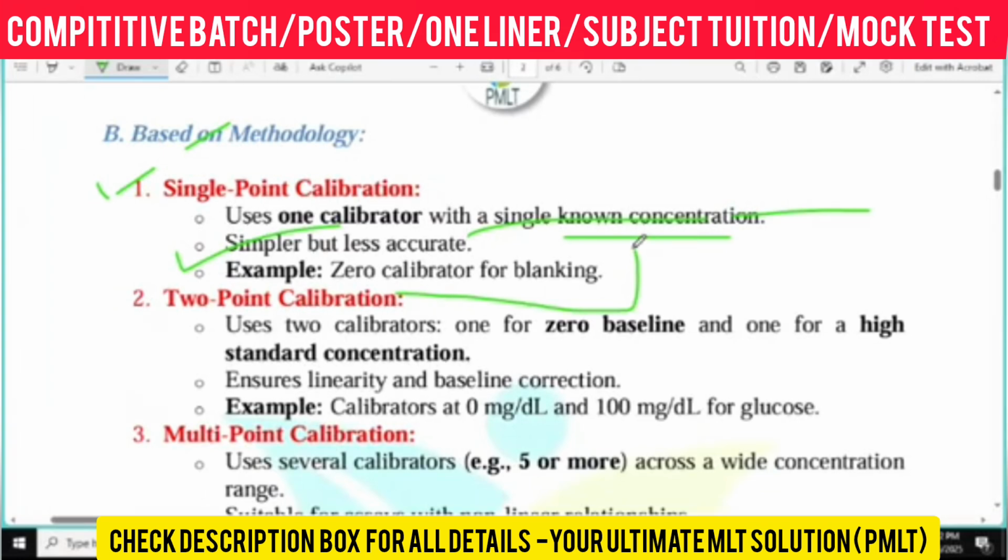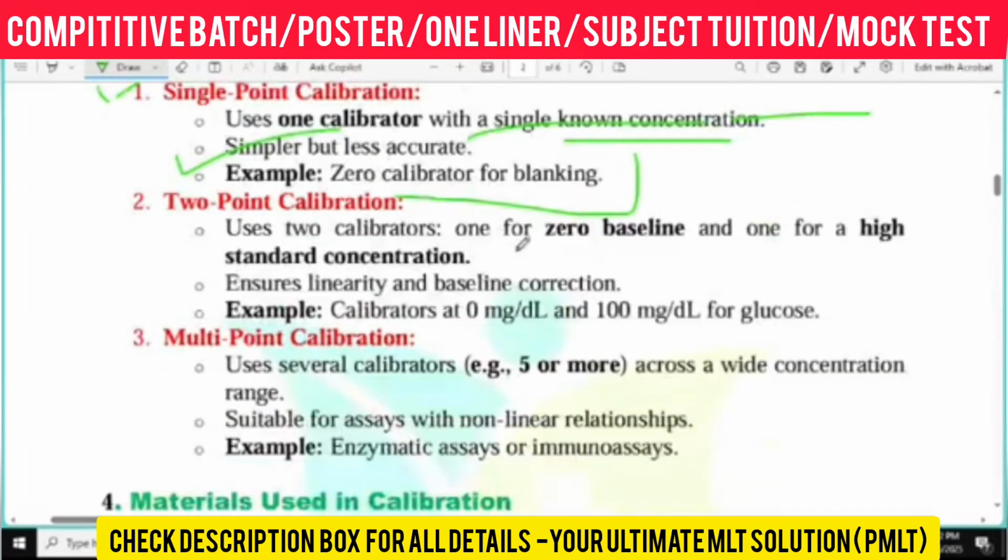Secondly, two-point calibration. Two-point calibration means one calibrator for the zero baseline and another for a higher concentration of standard. Getting my point? If you are using only one calibrator, that is called single point calibration.